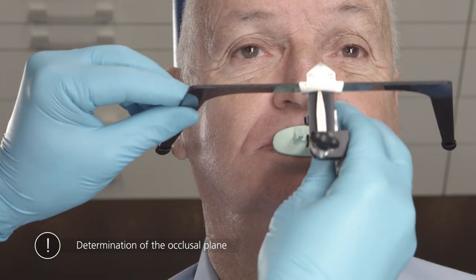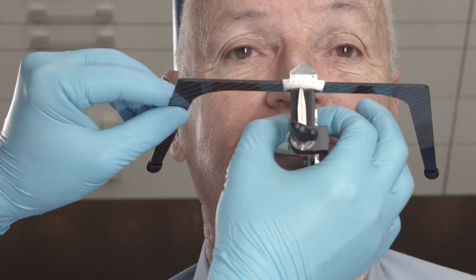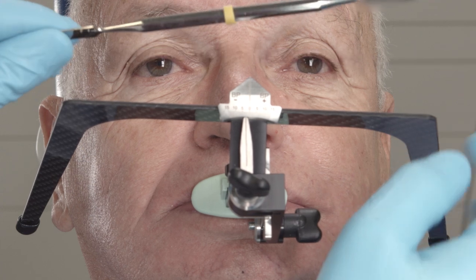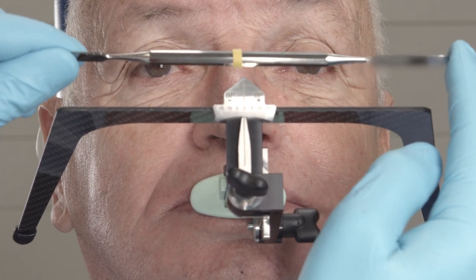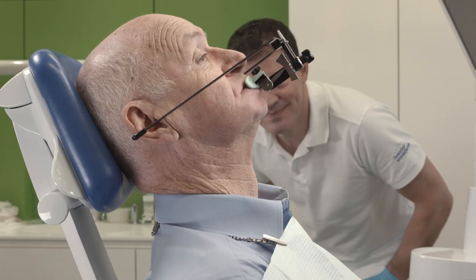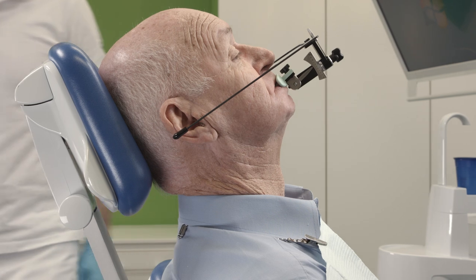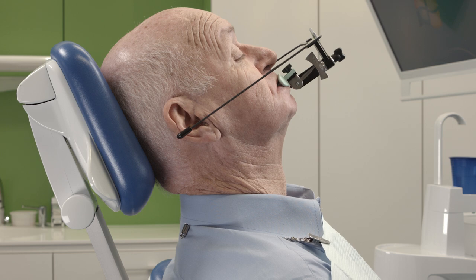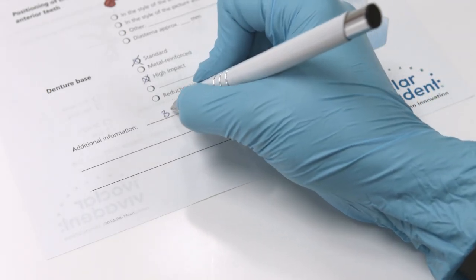Next, attach the UTS-CAD to the centric tray adapter. Adjust the basic bow of the UTS-CAD parallel to the bipupillary line and Camper's plane. You have now defined the preliminary position of the patient's occlusal plane. Record the adjusted values on the scale of the UTS-CAD and communicate them to the dental lab technician for the purpose of designing the 3D bite plates.